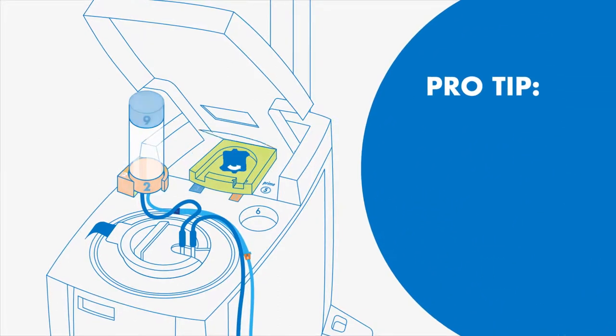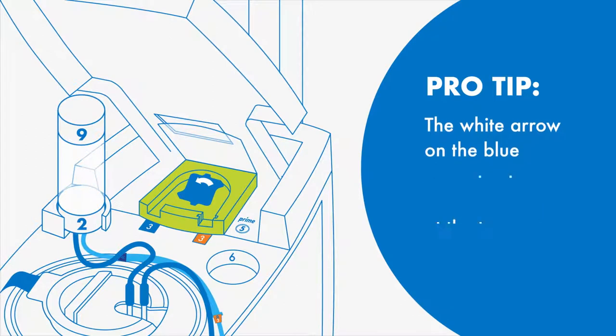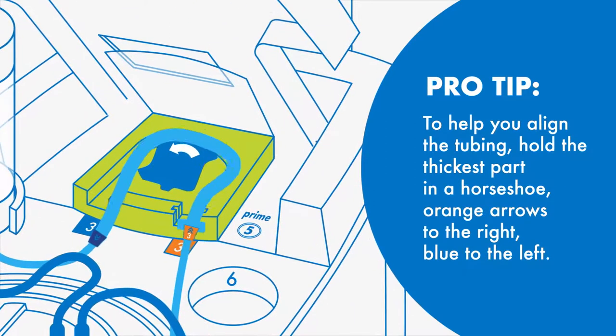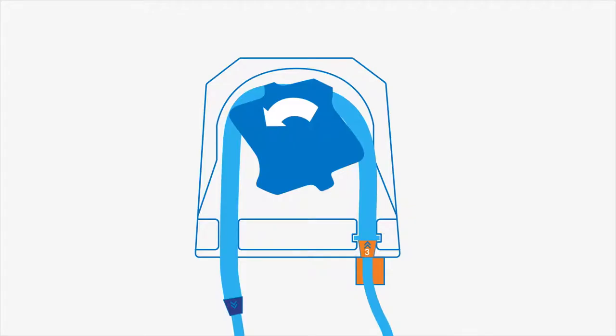Now open the roller pump lid. Fully insert the tubing disc into the orange slot, number 3, pressing it down. Orange 3 to orange 3.